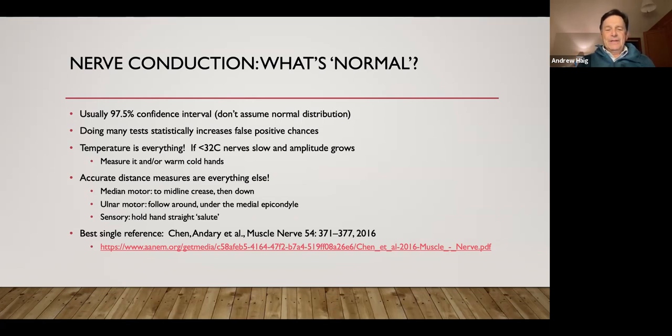We talked about the median going from the midline and then down, and the ulnar goes, when you're going across the elbow, you follow the ulnar nerve around the medial epicondyle with the elbow bent some to take the slack out of it. And with their hands, you want them to hold their hand real flat, like a salute, right?